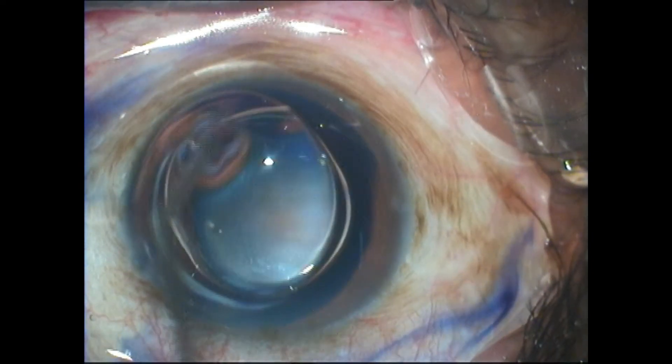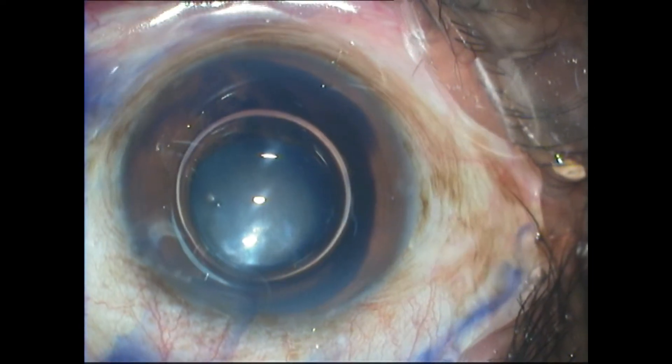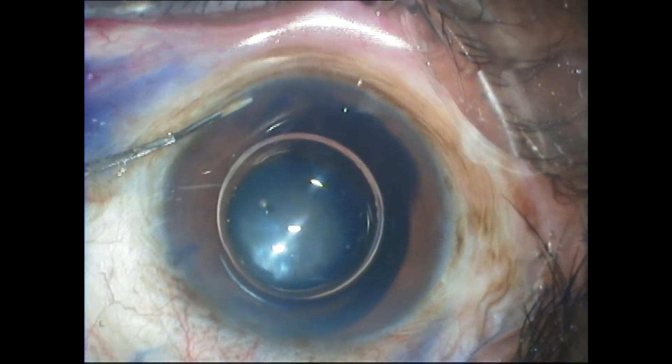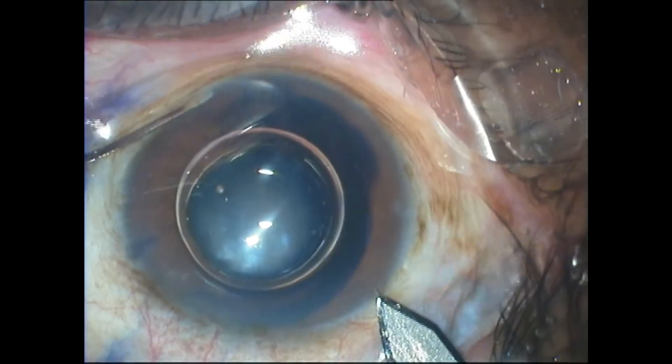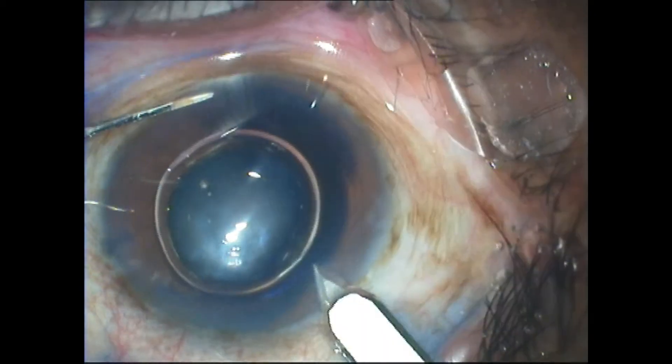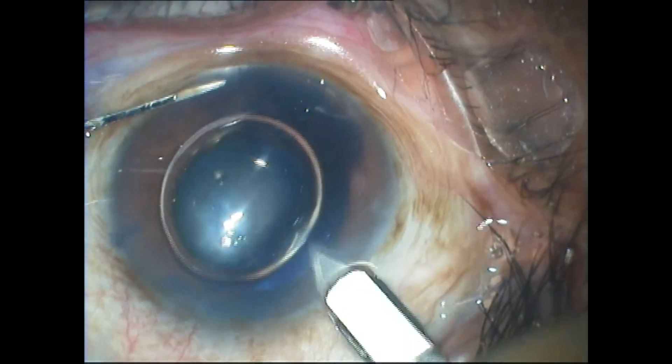This right amount of air is delivered by not priming the air cannula that is used. You can let this Trypan Blue remain until the incision is constructed, as it will not touch the endothelium and will have no deleterious effects.